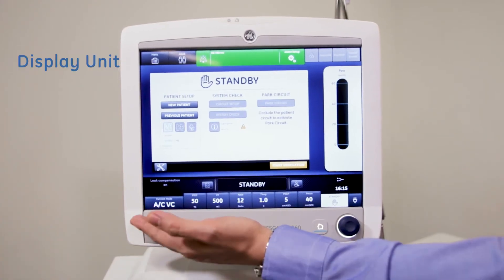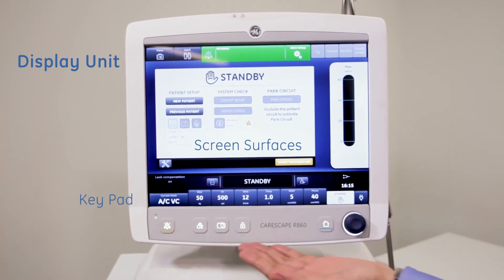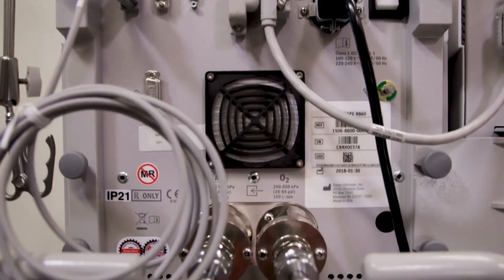The following parts can be disinfected manually using the wiping method with denatured ethyl alcohol 70% solution: display unit including screen surfaces, keypad, and trim knob; cables and cords; and external surfaces.